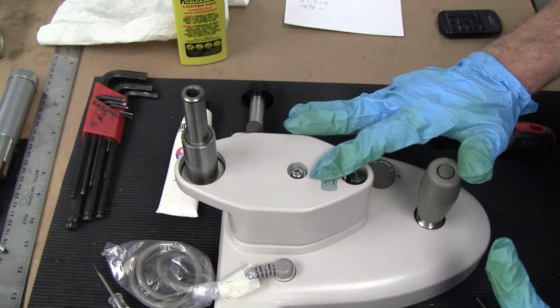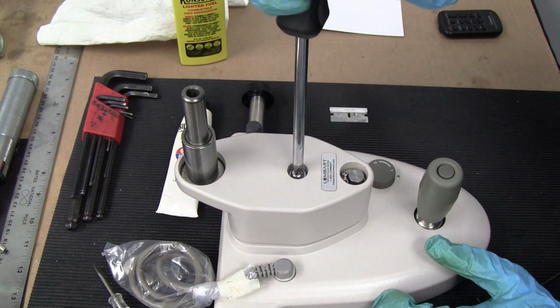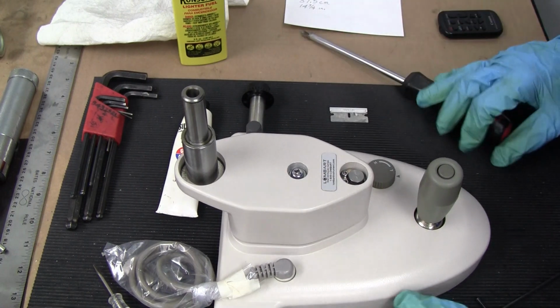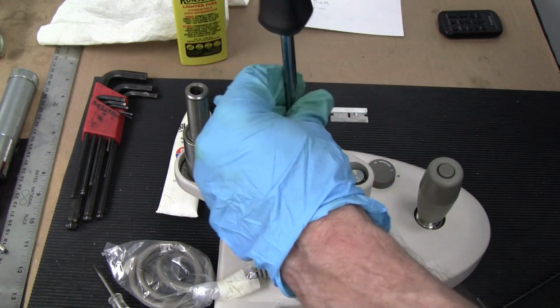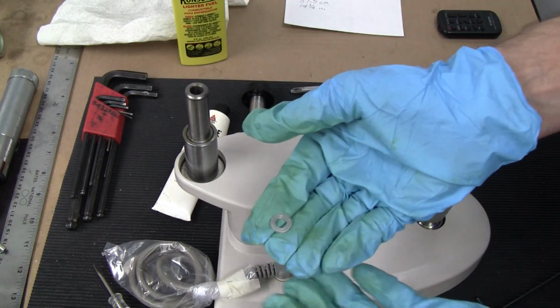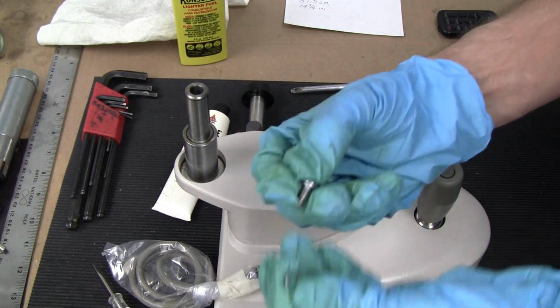And while we have this here, check, if you haven't already, to see is this screw tight that's holding on to your bearing assembly. If it's loose, then that could have been an issue. If there was some wobble, that could have been the issue. But what we want to do is, before we release any pressure, go ahead and take this screw off. And what Marco does, they just have a screw with a flat washer, and it will be bent, it will become concave because of the pressure tightening on here.